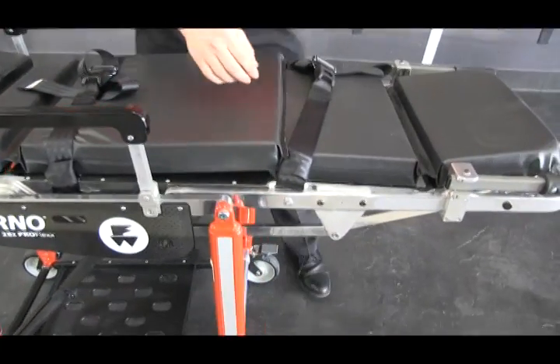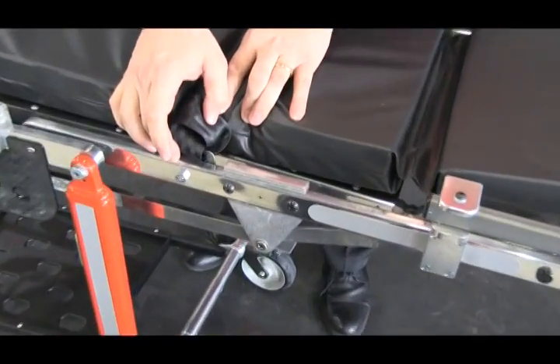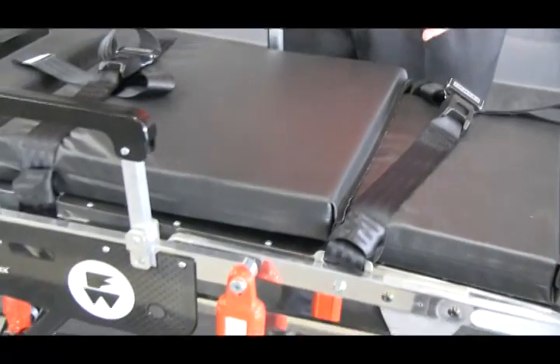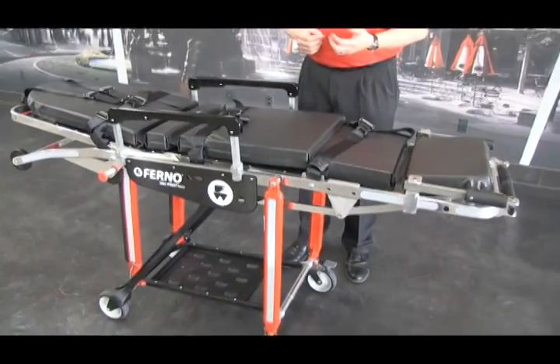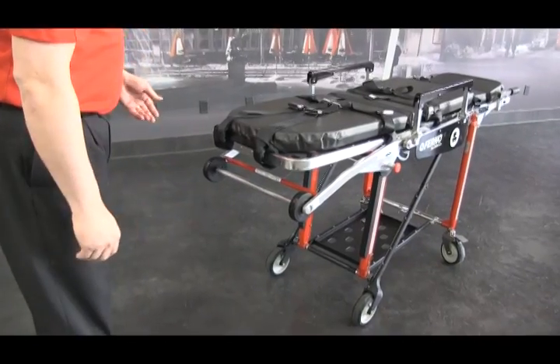You want to make sure the buckle stays in the seat area. The last restraint is the leg restraint, which has a bracket attached to the leg frame. The waist and leg restraints are designed so that when the cot is transferred into a chair position or back to a stretcher position, it moves with that section so it doesn't tighten or loosen as the cot is repositioned.